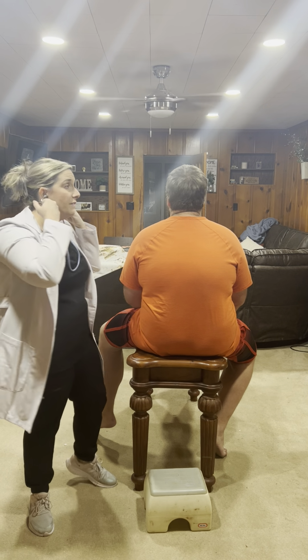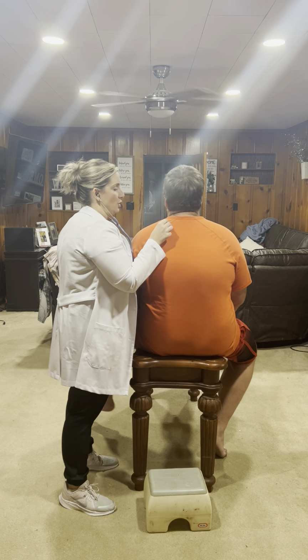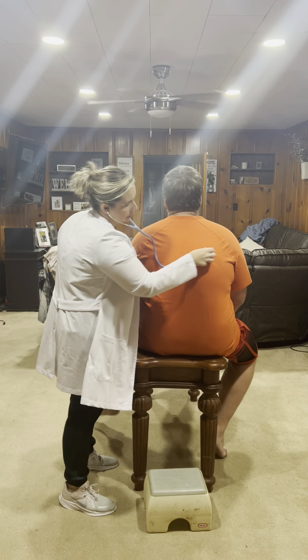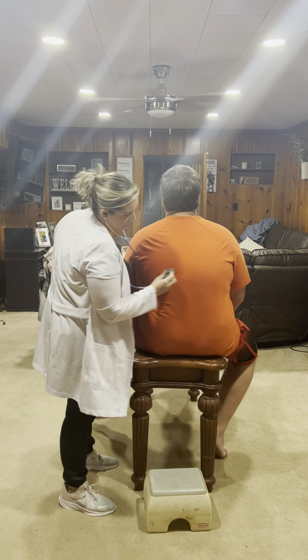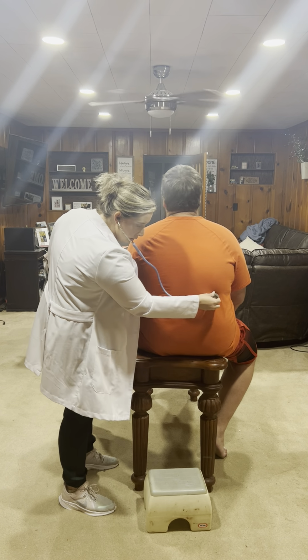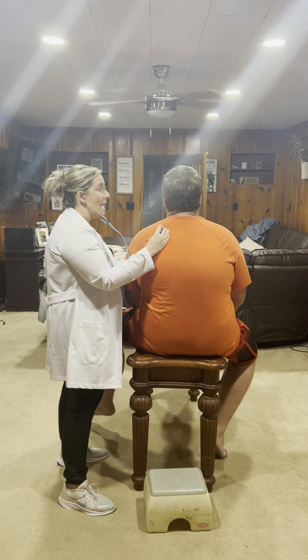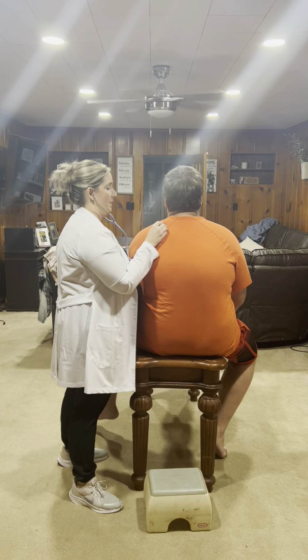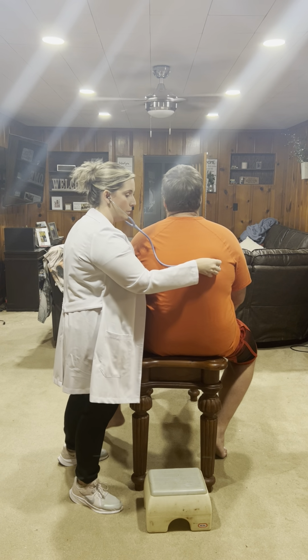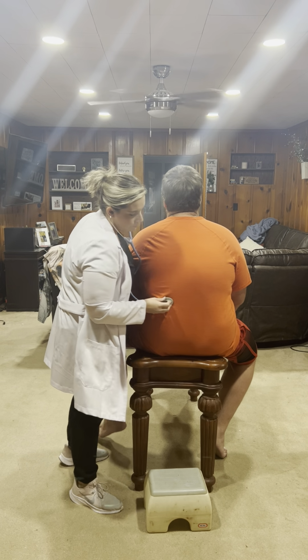I'm going to do egophony. Say E when you feel my stethoscope touch your posterior chest. E, E, E, E, E. Bronchophony. Say 99 when you feel my stethoscope touch your back. 99, 99, 99, 99, 99.